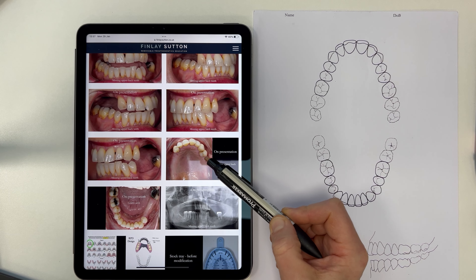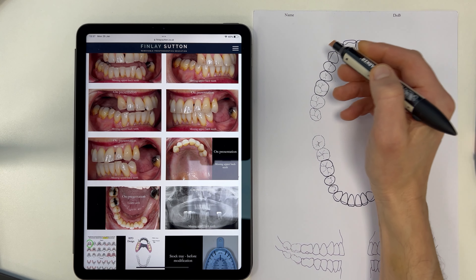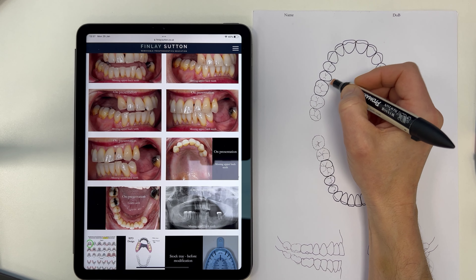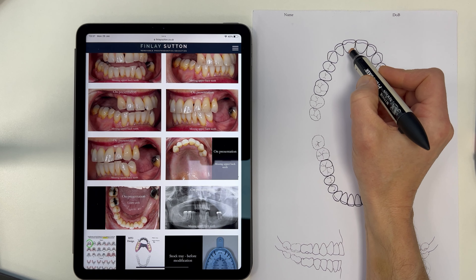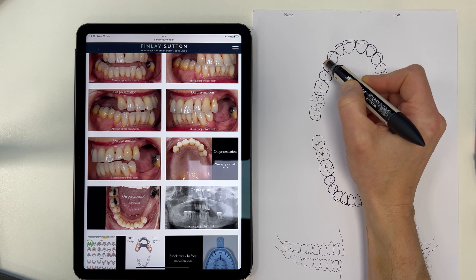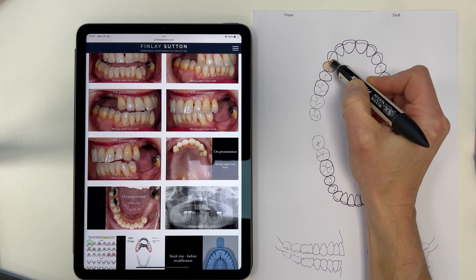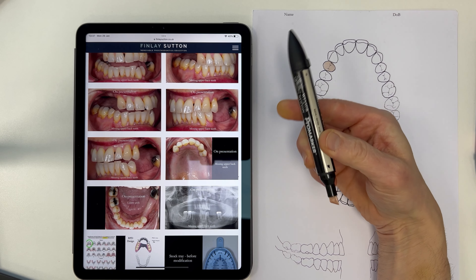This is for Sue. I'm just going to look at what teeth we need to replace first — that's the first thing I'm going to do. On here I just color in the missing teeth, so we've got the central, lateral, and canine there — I'm just going to color in those missing teeth.